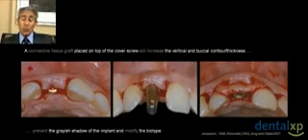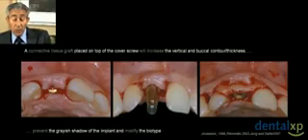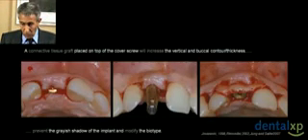That's the case. You saw the flap design where we were starting with the tooth having a fistula, and it was not possible to put an implant at that time immediately. So we let it here for 8 weeks for the tissue to cover totally the alveolar socket. So when the tissue was thick enough, we decided to make a vertical incision, taking the papilla on the adjacent teeth, the distal papilla on the adjacent teeth, and a palatal crestal incision on the occlusal site.